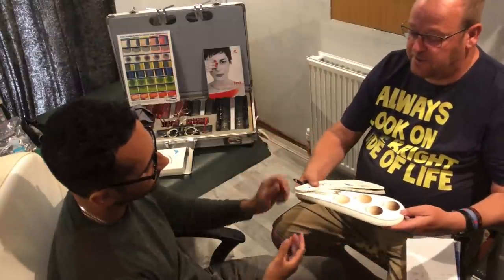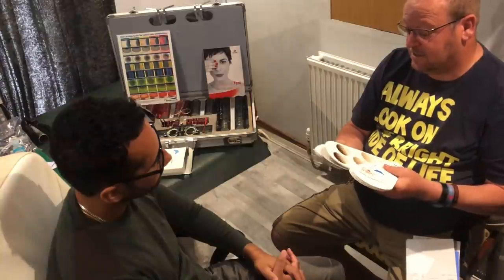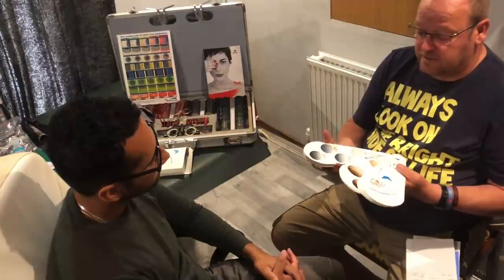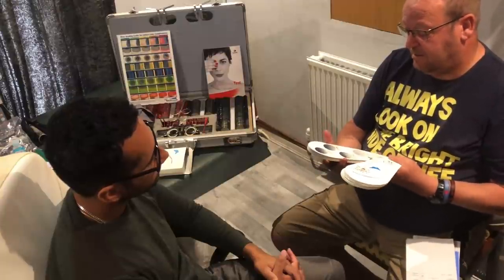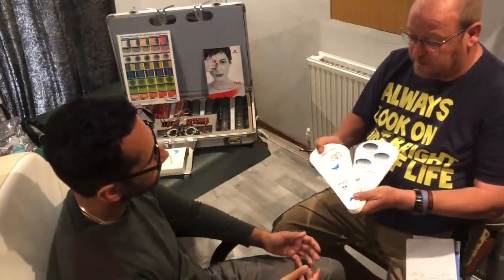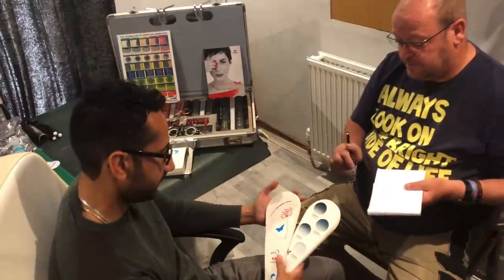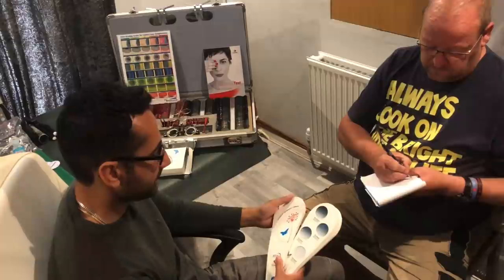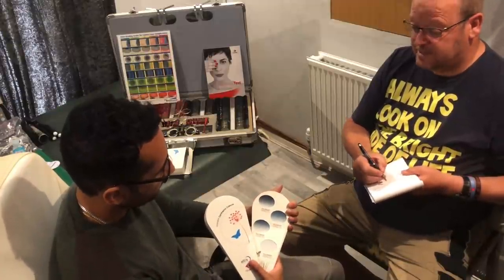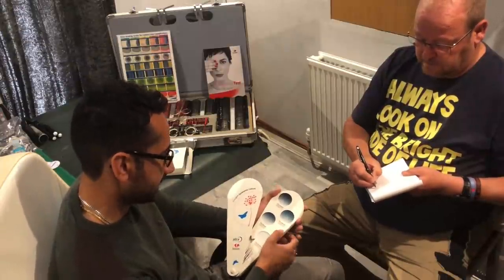I'm going to show you next more graduated colours — it's colours you've already seen but this time in the graduated. And what you will notice with the grey is it doesn't look as dark at the top with the graduation coming in. With the graduation it almost gives you a blue hue, doesn't it? I think for sunglasses, depending on the colour of your frame — I think it'll be black, so it'll be grey. So the grey supersedes the brown graduated tint. Same absorption factor, please.